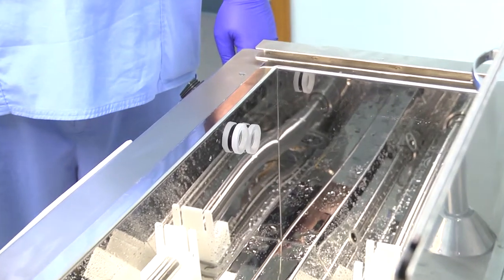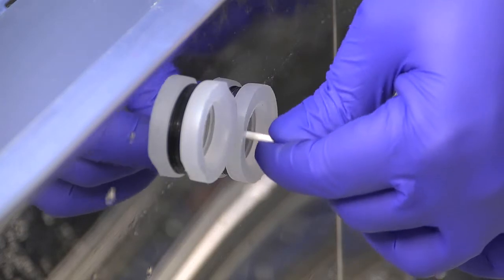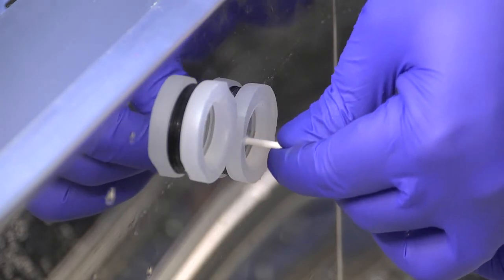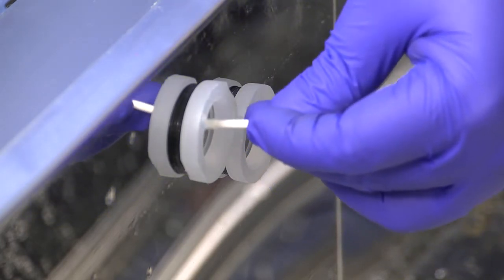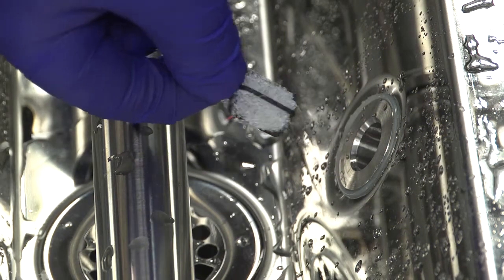At the end of each day, operators should clean the water level sensors inside the machine. Using a clean cotton swab, clean the primary level sensor and the overflow sensor. Also, the basin filter should be changed at least once per 8-hour shift.